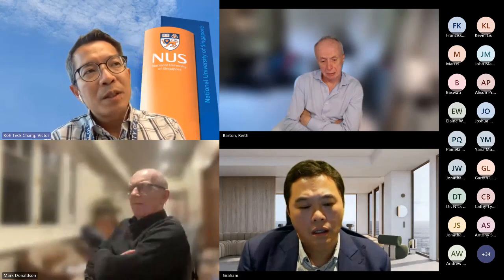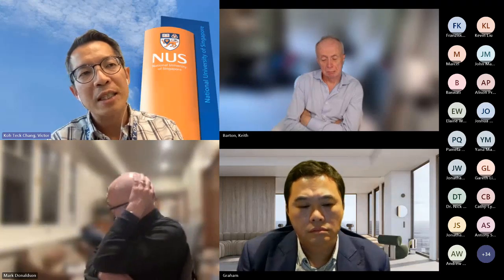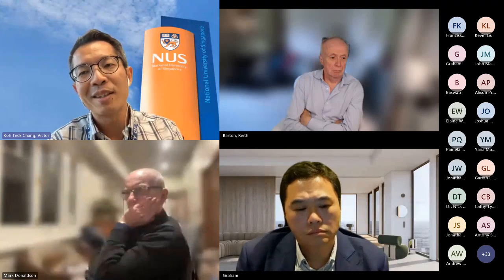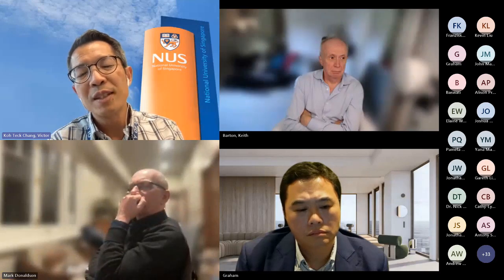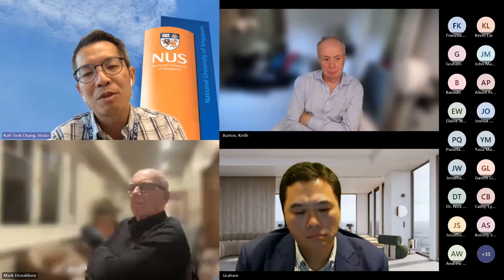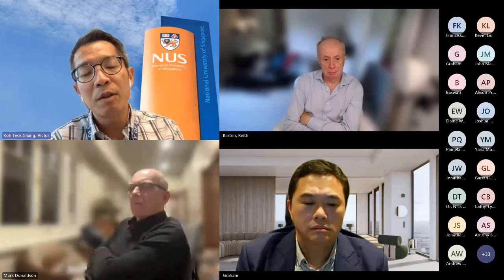Thanks, Hugo. Any other comments there, Victor? Do you do anything different? You know, Graham, what Keith says is true. I think we are talking about reproducibility and predictability especially in the early post-operative period. For a novice surgeon, I think putting in a stent makes you sleep better at night. That's number one. Number two, not all the stents need to be removed. If you use the Vicryl, then you almost always will get it resolved by maybe 4 weeks or 6 weeks, and then that opens up, and some of them may crash in terms of pressure. Whereas with the stent, you could potentially leave it there, right? And not having to remove that as well.